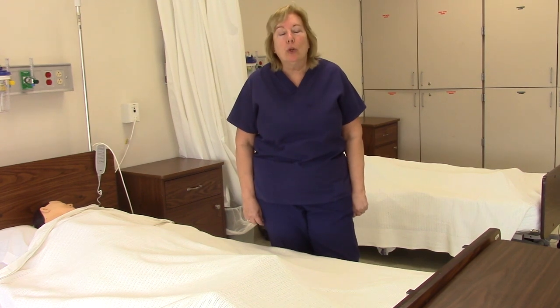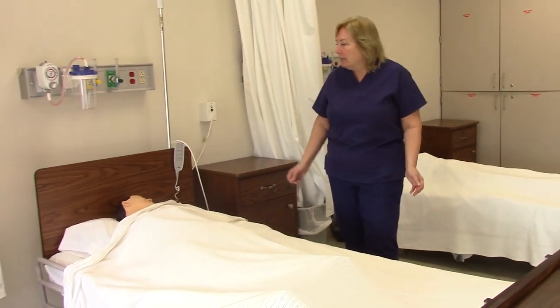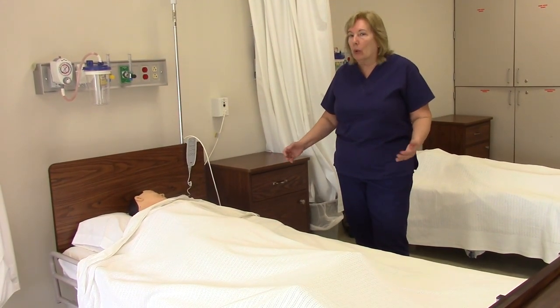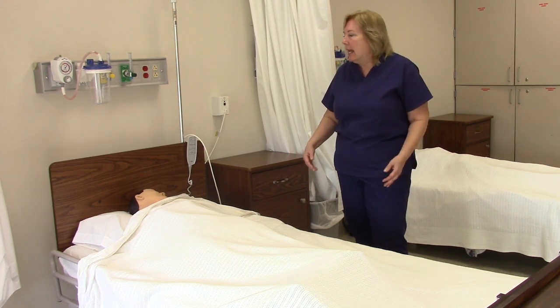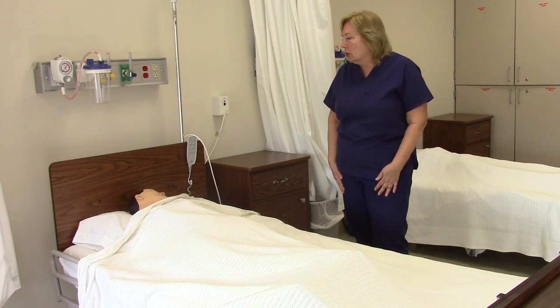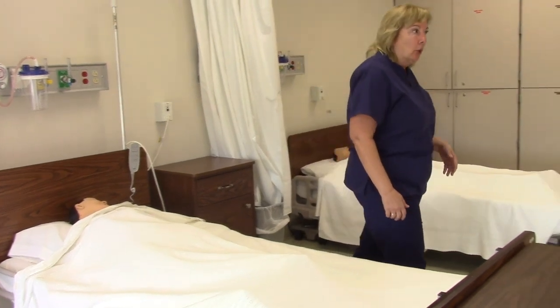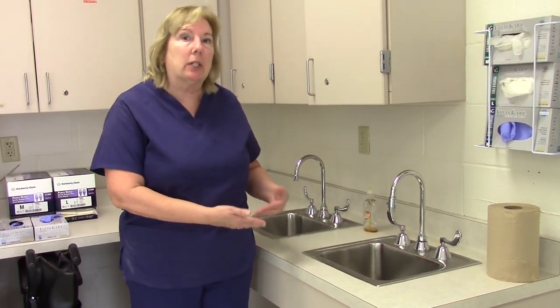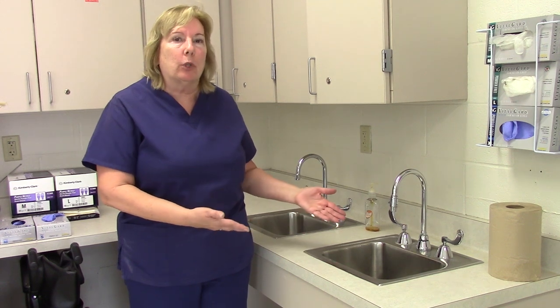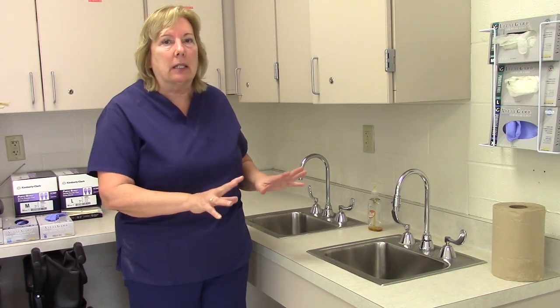The first thing you should do with your patient is to always knock at their door. As you enter the room, introduce yourself: 'Hi, I'm Karen Tam. I'm your nurse today' — or nursing student, certified nursing assistant — 'and I'm going to empty your Foley bag and measure your output today. How are you feeling?' Then wash your hands for 15 to 20 seconds. When you turn the water off, use a paper towel, because wetness does spread infection.